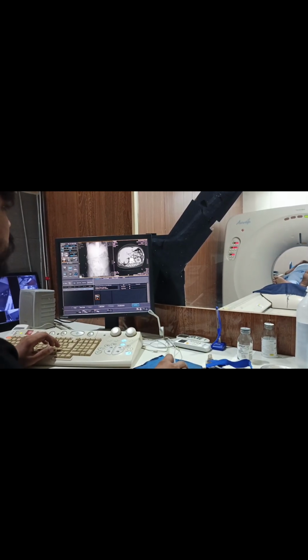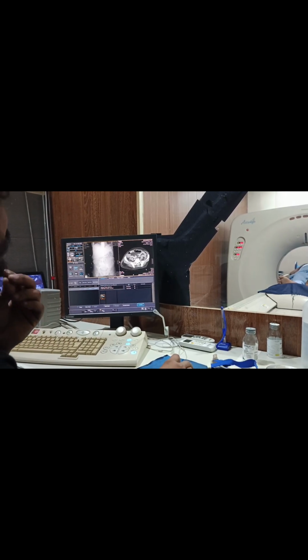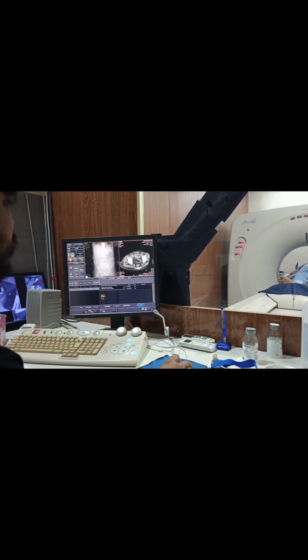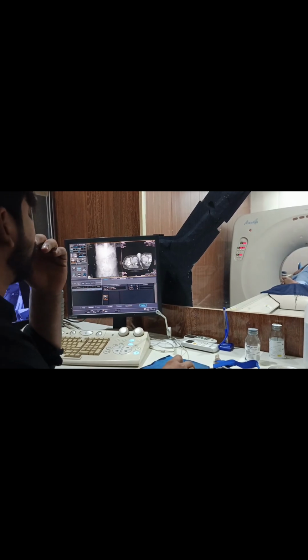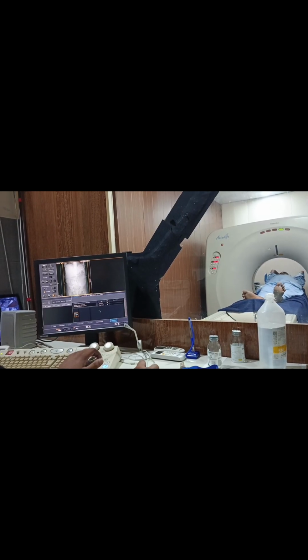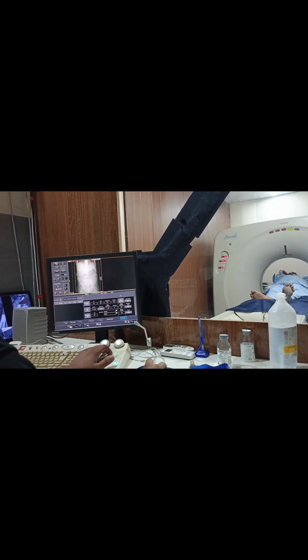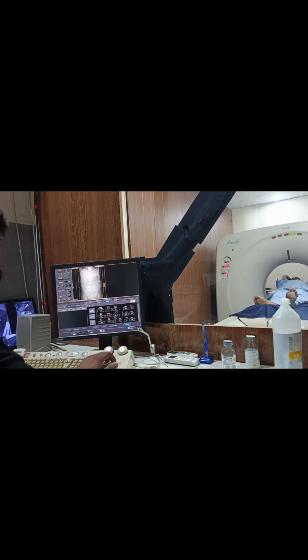Advanced analysis tools may include contrast enhancement studies, where the radiologist compares images taken before and after contrast injection to study the flow of blood through organs. This helps detect tumors or blockages. The radiologist can also generate three-dimensional reconstructions of blood vessels or bones, providing surgeons with detailed maps before operations.